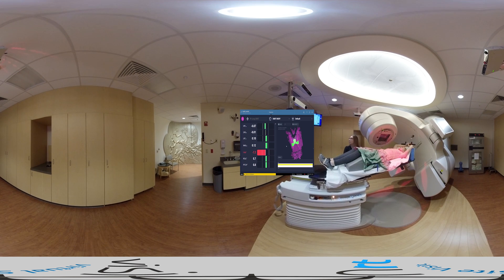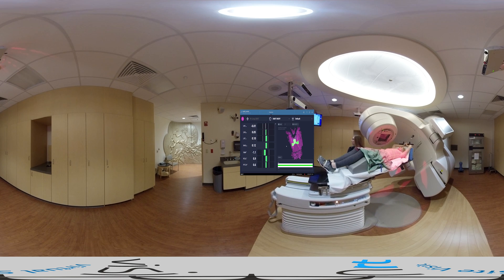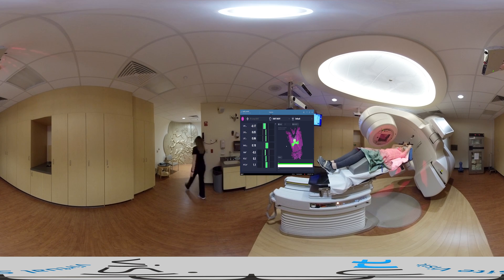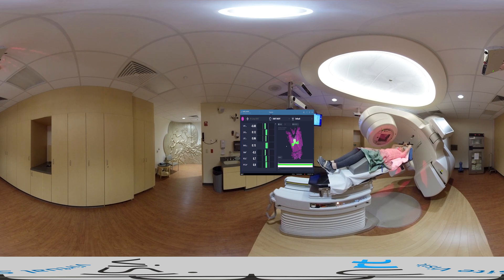If the patient moves, we can see it in real time. If the motion exceeds a defined threshold tolerance, any affected threshold bar turns red and we can turn off the beam. AlignRT can also hold the beam automatically if any threshold tolerance is exceeded. It's a great safety net when treating high-precision treatments.